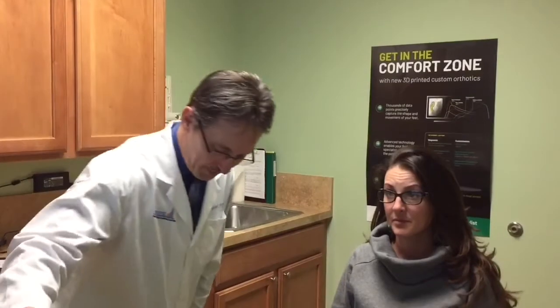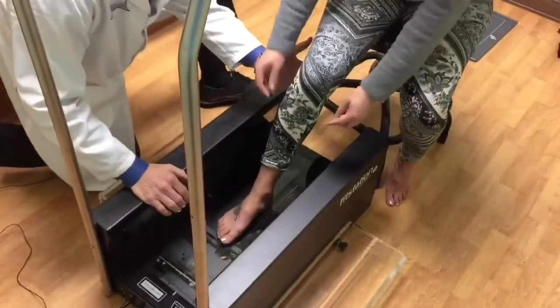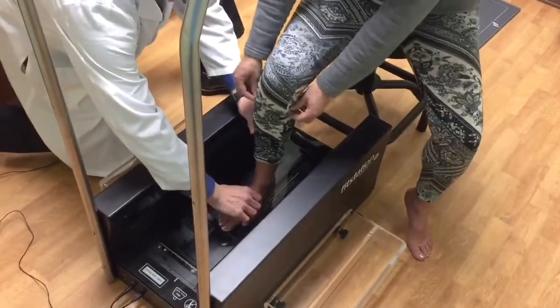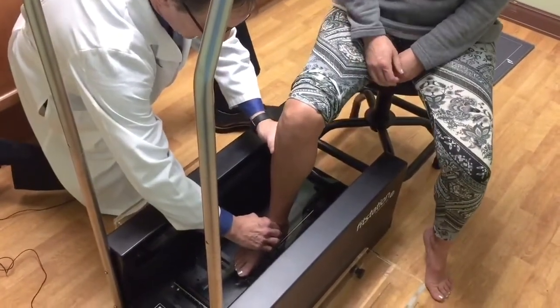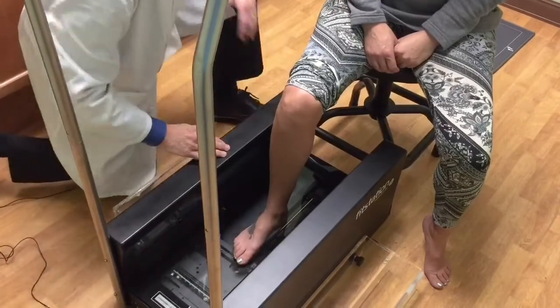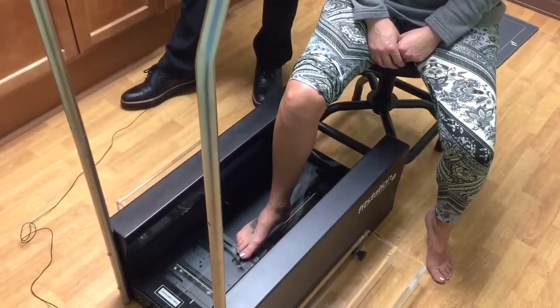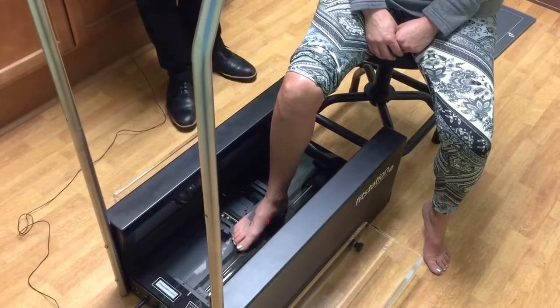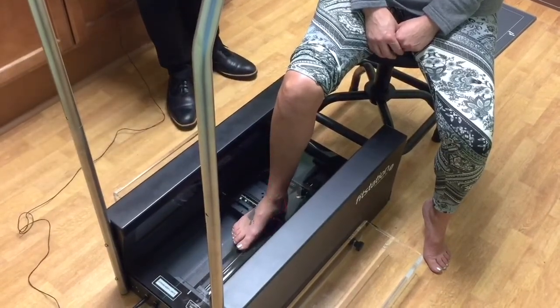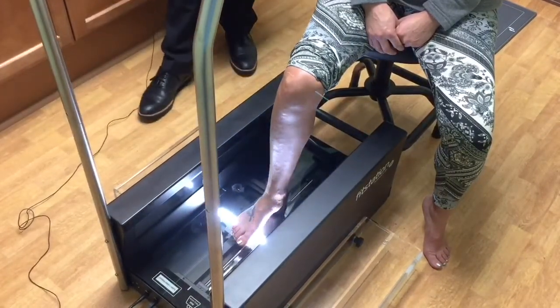Now I want to show you how it works because this is really neat stuff. We're going to position the patient's right foot into the middle of the scanner. I get her positioned into the scanner set up properly into the appropriate position to capture — and watch this. She's in the scanner and we're going to do a laser scanning of her foot. This is a class one laser so it's safe; we don't have goggles on during the process. It captures the 3D image of her foot and renders it onto the computer screen in front of us.